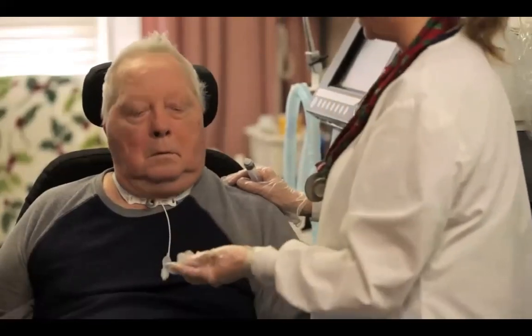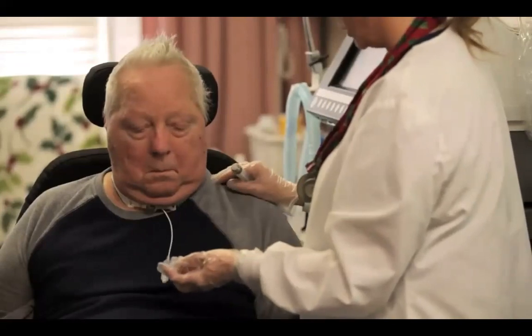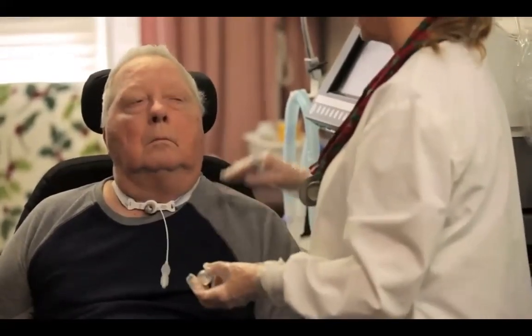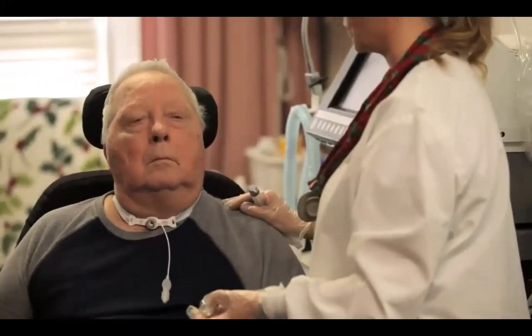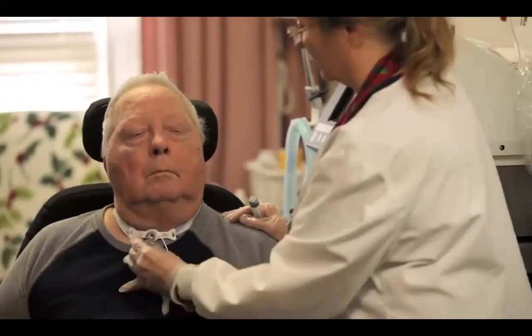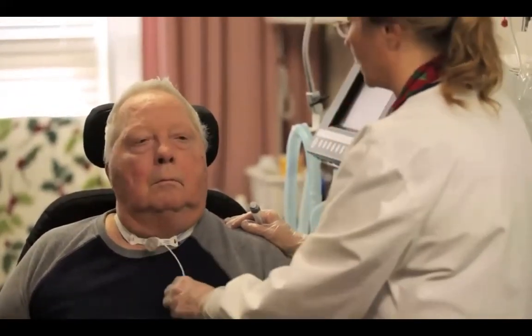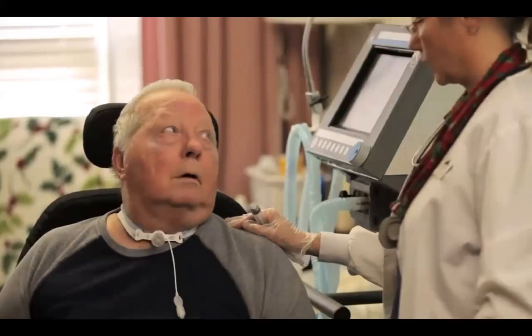Yeah, it's real soft though. Now I'm going to take this valve and place it onto your trach tube, okay? And that hopefully will give you enough boost to get that stronger voice. Are you ready? You've got just a little turn, and it's in place. And I can talk. And you can talk.